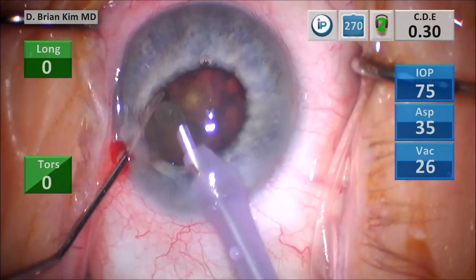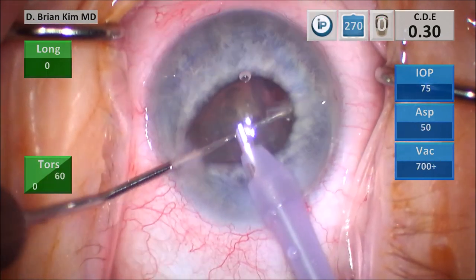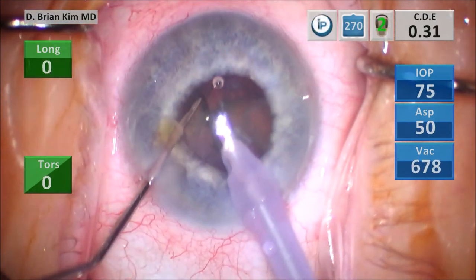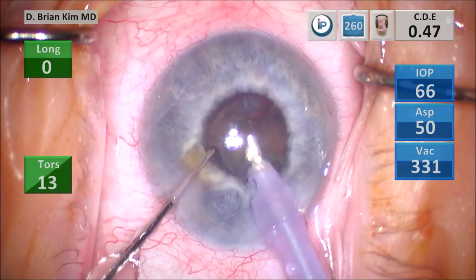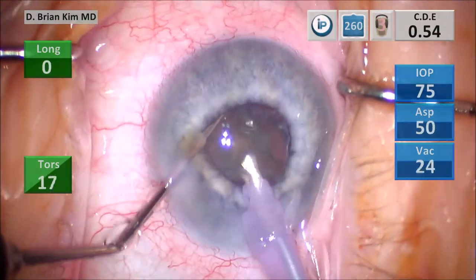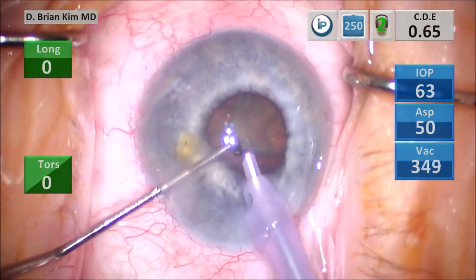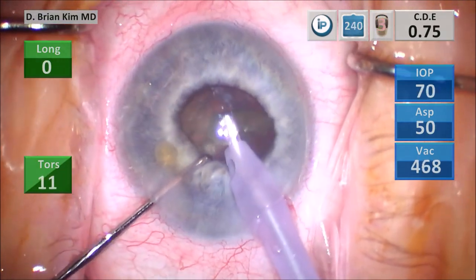I pulled that second quadrant out of the bag using the chopper and I'm just very carefully removing it using high vacuum. I turn the second heminucleus in front of me, place the chopper out to the equator, and crush the lens piece between the chopper and the phaco tip. I'm using a little bit of vacuum to pull that third quadrant out of the bag gently. I'm using the chopper to keep that sub-incisional iris away from the tip. I gently pull and crush the piece using mechanical fracturing forces and some vacuum. You can see it did grab the iris again, but because I'm using the chopper to hold the iris, I'm able to minimize any trauma to that sub-incisional iris.